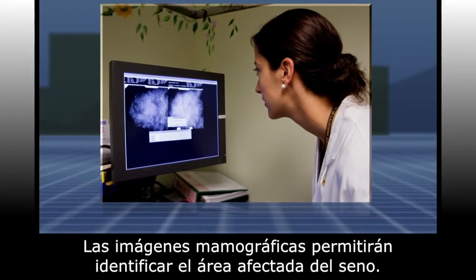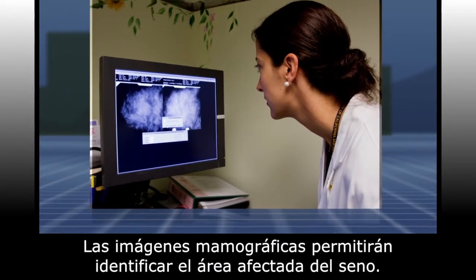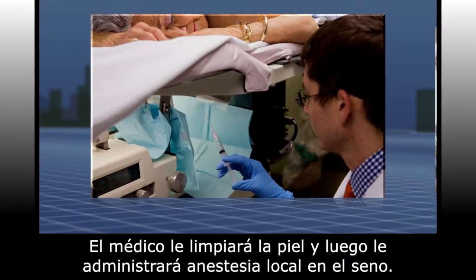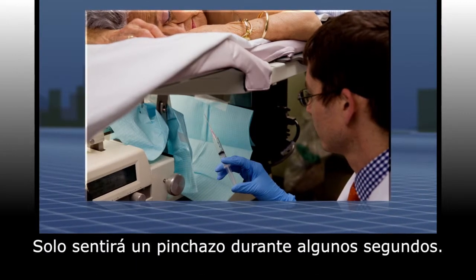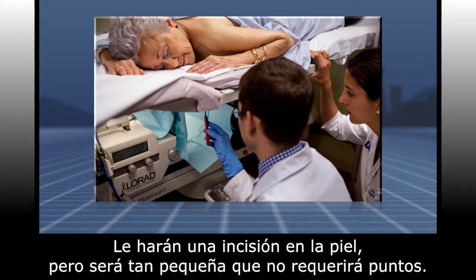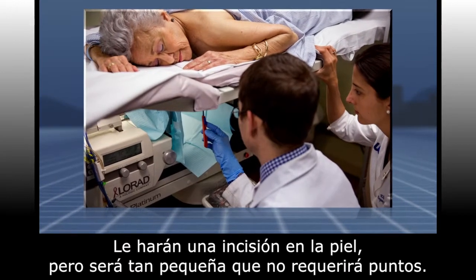Mammographic images will identify the target area in your breast. After cleaning your skin, your doctor will administer local anesthetic into your breast. This will sting for just a few seconds.